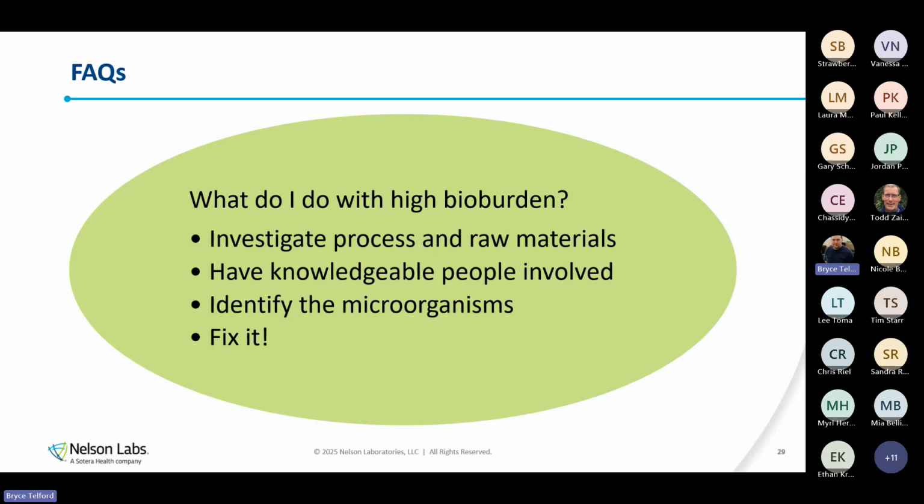Goes back to his team, and they had had an issue with their product. They had had an issue with residuals. They weren't really specific to me on what the particular cause was, but the decision was made to rinse the product with water. And they figured that shouldn't be an issue because it's water. There shouldn't be a residuals problem. Well, that rinse, they didn't have the knowledgeable people involved on what they're doing and why. They didn't understand the microbiology aspects. They were really only concerned about the residual aspects. And the person that I was working with did not know that that step had been introduced as part of a change to the product and production.